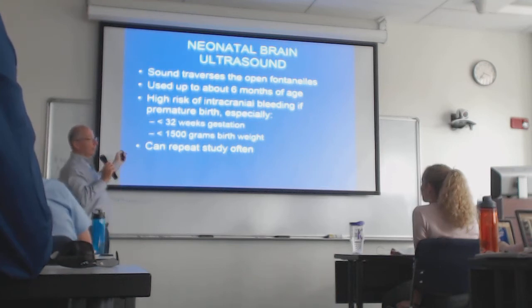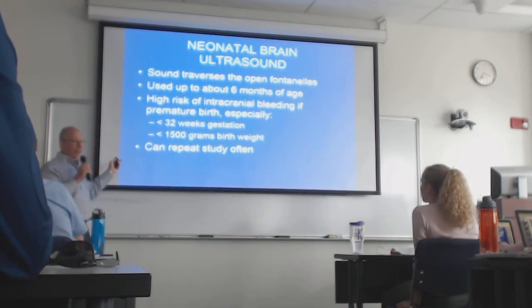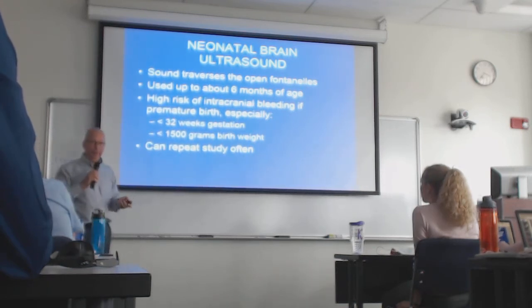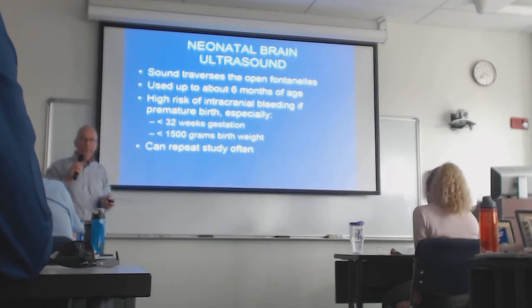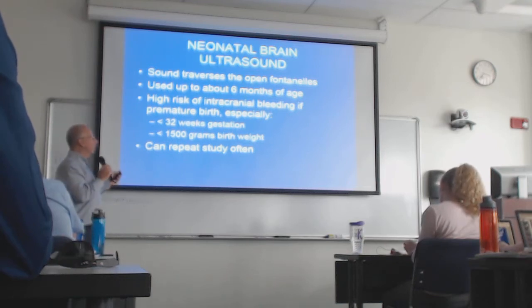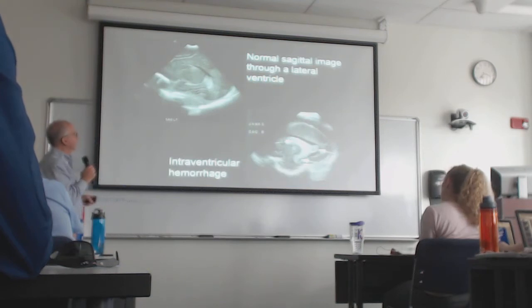The good thing about ultrasound of the neonatal brain is that you can do it every day. In fact, you do it every day. In a neonatal ICU, we would scan these kids every single day, just until they were old enough, or well enough, to get out. So you're not hurting anybody by doing the scan.